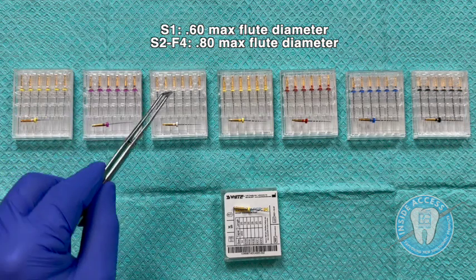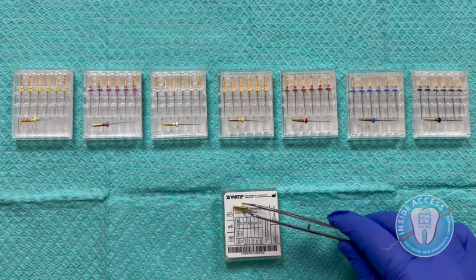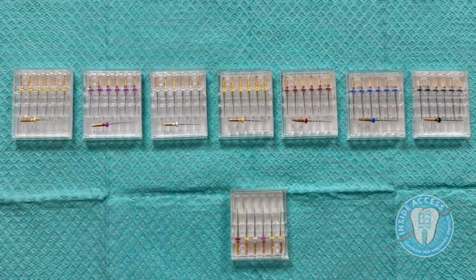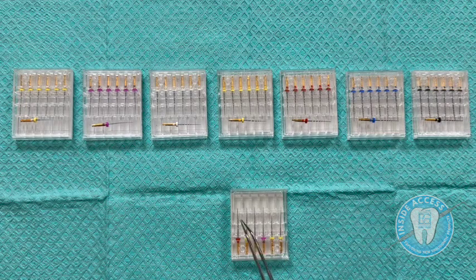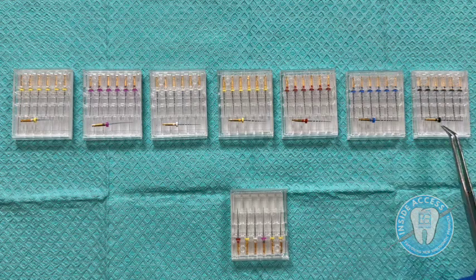Each of these files is available individually packed in a six-pack, consistent across each file. You also have the option of an assorted pack, which includes the SX orifice shaper, the glide path file, the S1, S2, F1, and F2. The F3 and F4 can be purchased in individually packed six-packs.